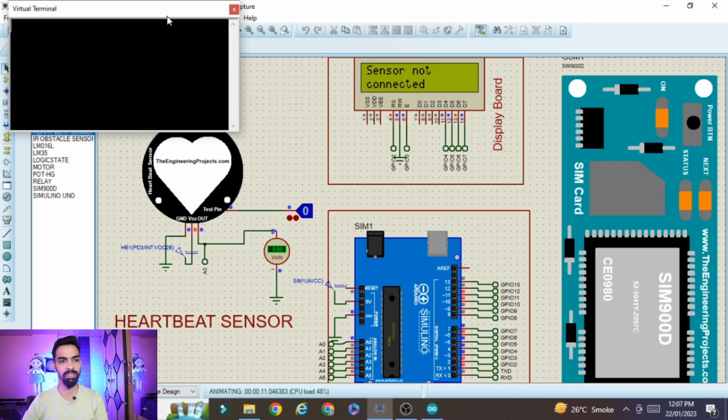Now you can see on the screen, if I give the one signal here, then sensor connected and pulse is detected. If pulse detected means a high pulse is detected, pulse not detected means a low pulse is detected. So I will start giving one signal here. So you can see the timer is 12 seconds right now. Here you can see 12 seconds, high pulse detected. So after approximately 23 seconds you will get the final count here. So wait for 10 seconds, or you can see from here 23 seconds, because we have given one signal at the 13 second. So plus 10 is 23, approximately you will see the final count.